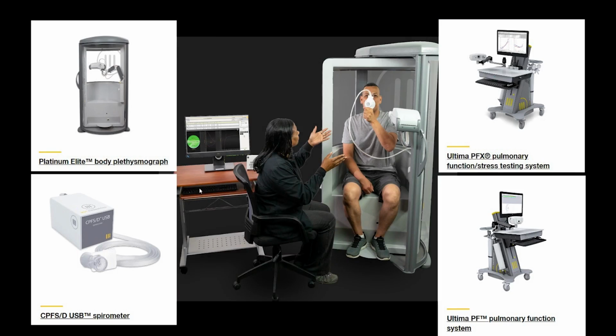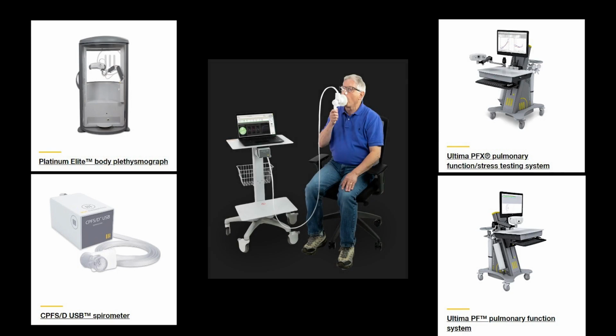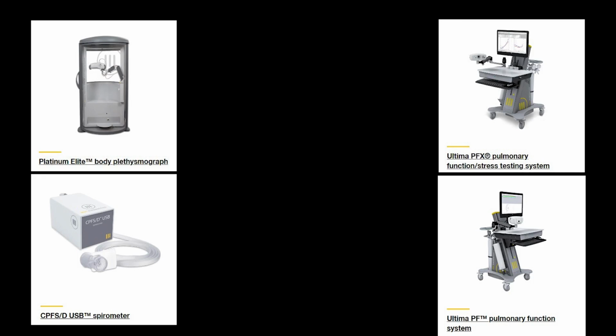Quality control on the system should be performed according to the ATS guidelines, following a complete calibration to ensure optimal performance of the system. The frequency of QC may be increased depending on the size of the laboratory and the number of tests performed. The technician performing the QC testing should be familiar with all testing procedures to ensure that there are no technique errors.